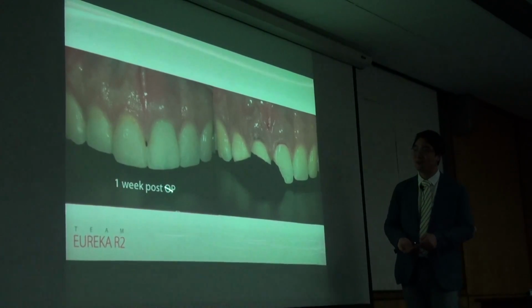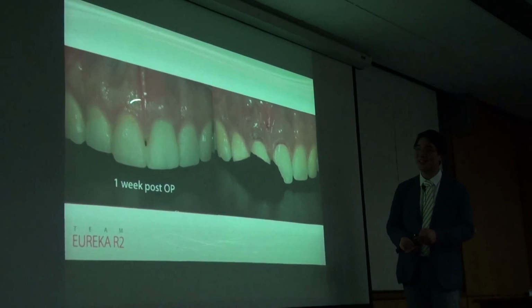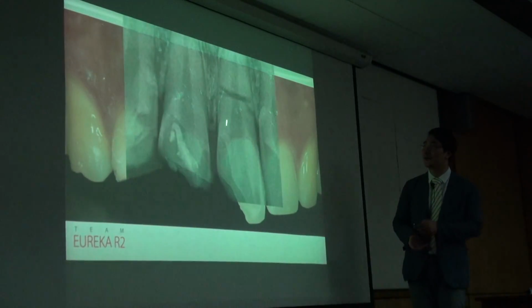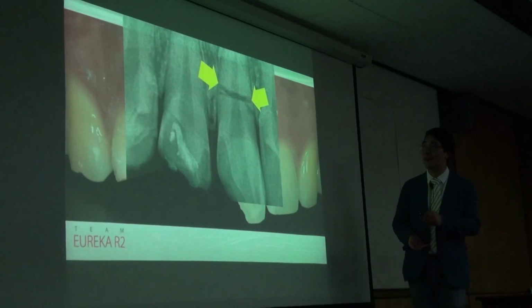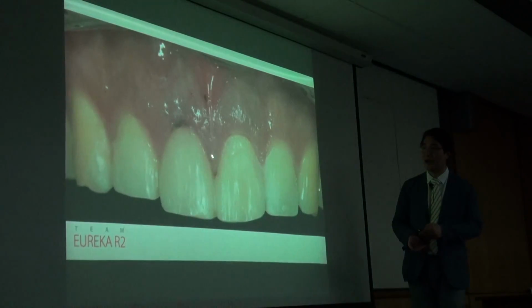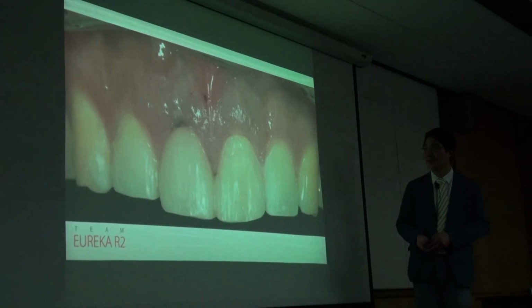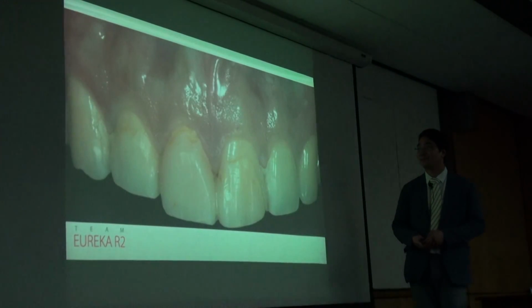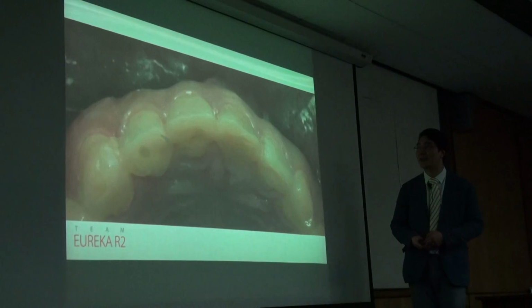So anyway, we made this kind of result one week later. Unfortunately, this tooth is totally broken. So in one day, immediately root canal therapy and build up the resin for aesthetic reasons. And then take an impression and send data one week later, before starting the surgery.